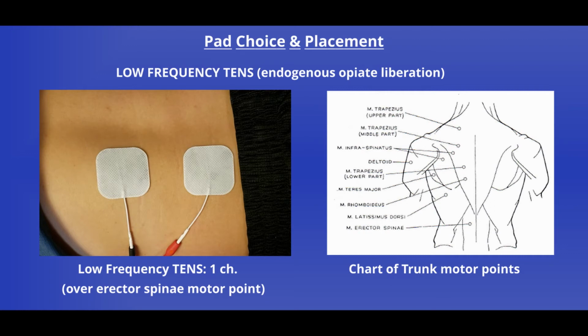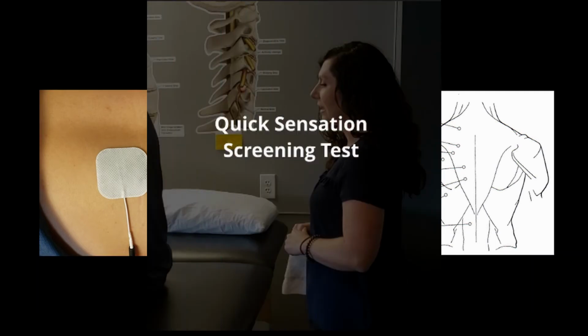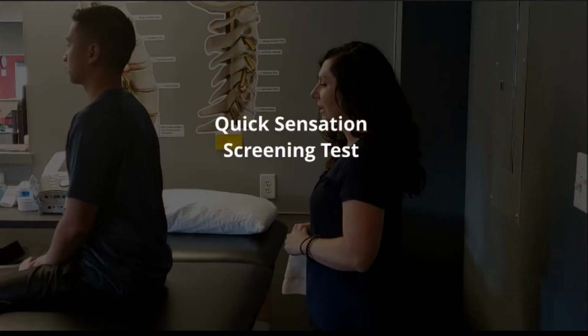For safety purposes, it's helpful to ensure the patient has normal sensation in the area that's going to be treated. You can confirm this by checking in the patient's chart or performing a quick sensation screening test before treatment.